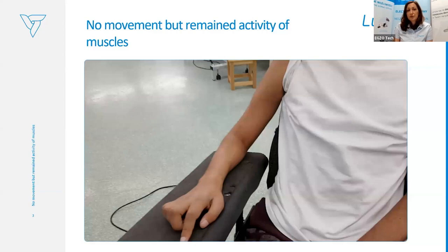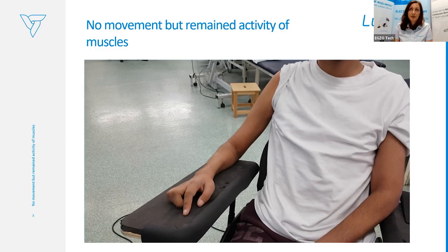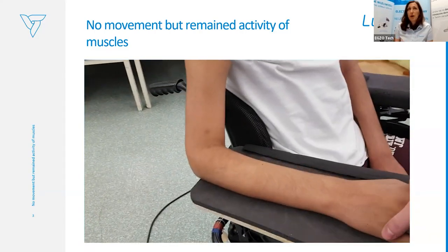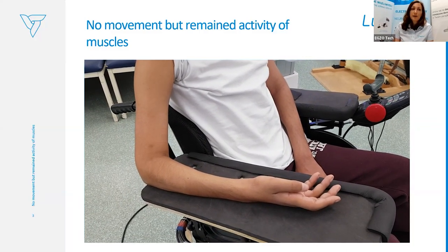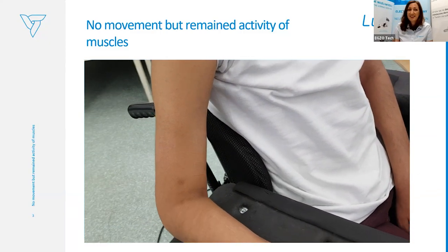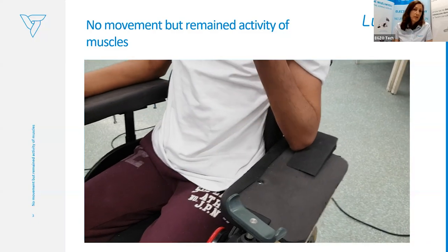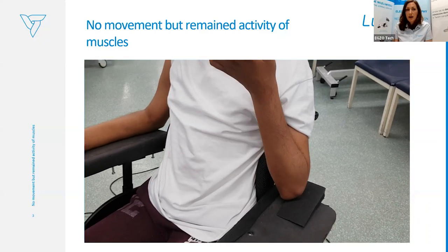I will explain how it works on a patient video. Here you can see a patient after spinal cord injury — C4 level injury. We were assessing and asking him to contract the muscle, to make a movement, to flex the elbow, and he wasn't really able to activate the biceps visibly. In comparison, the left-hand side is way better, so we could perform at least biceps flexion and extension.